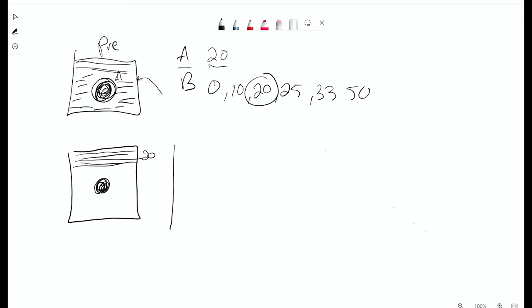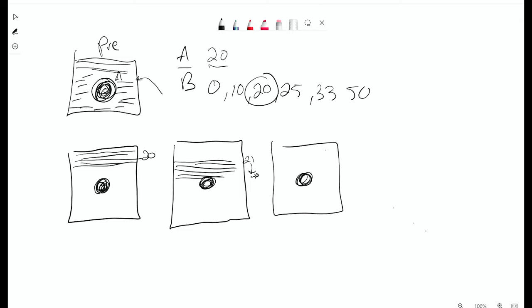Okay. So then here comes my next sequence, and I'm going to fill 20% of the center, and I'm going to fill 20 to the 40th percent of K-space here. So 21 to 40%. You see? Yes. Okay. Next one comes along, and I'm going to fill the center again. So I'm still getting really high temporal resolution, but now I'm going to fill another 20% of K-space. So now between here, here, and here, I filled 60% of K-space. Now remember, I don't get my images until 100% of K-space has been filled.